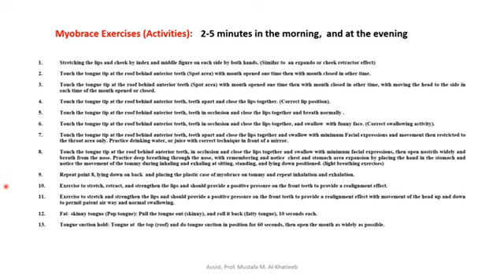Myobrace exercises: 2 to 5 minutes in the morning and in the evening. I summarize them. Stretch the lips and cheeks with the index and middle fingers on each side, using both hands, similar to an expander or cheek retractor effect. Touch the tongue tip to the roof behind the anterior teeth with the mouth open one time, then with the mouth closed one time.